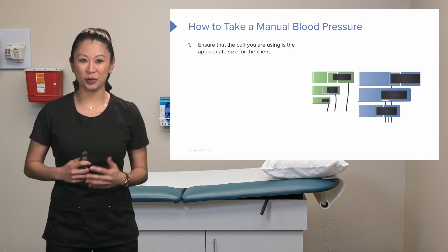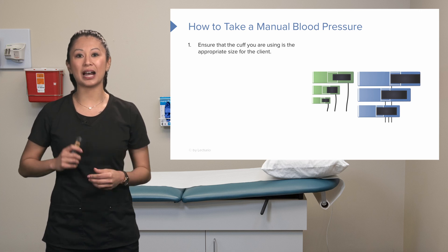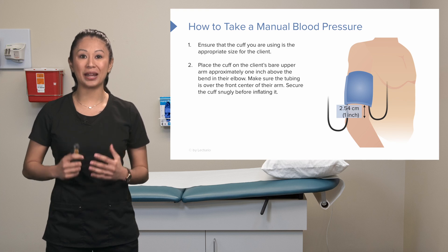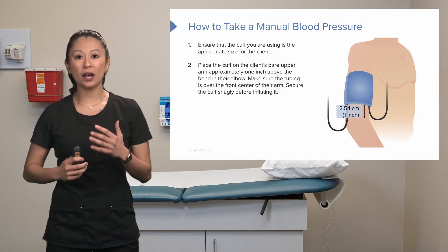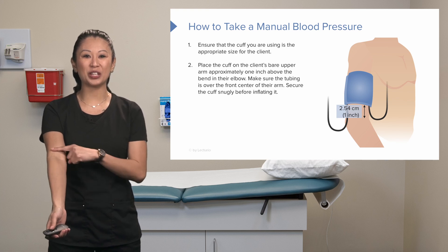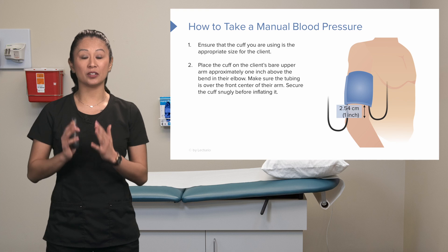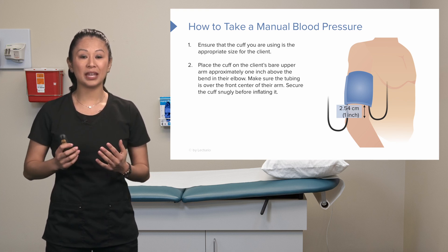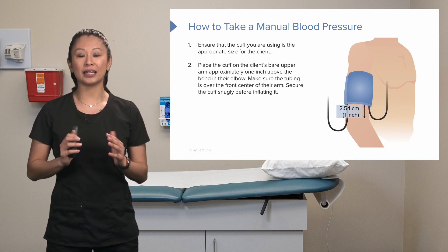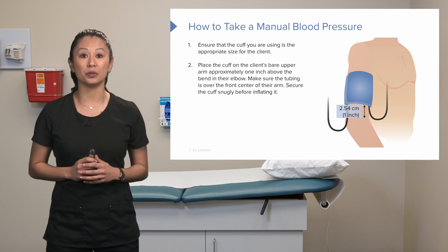First of all, make sure the cuff you're using is the appropriate size for that client. We're going to place the cuff on the client's bare upper arm about an inch above the bend in their elbow, otherwise known as the antecubital space. Make sure the tubing is over the front center of the arm and secure the cuff snugly before you inflate.